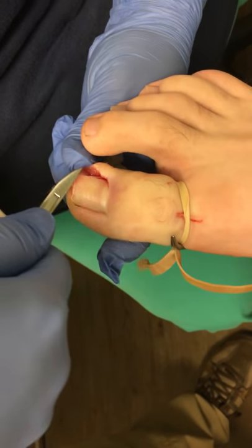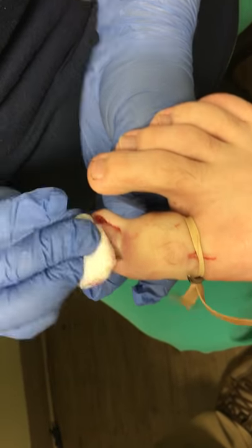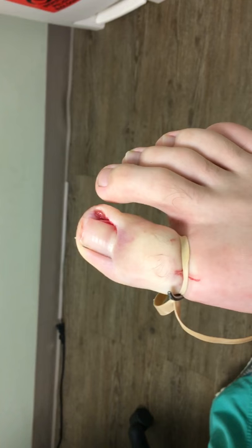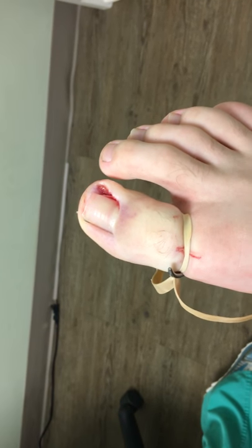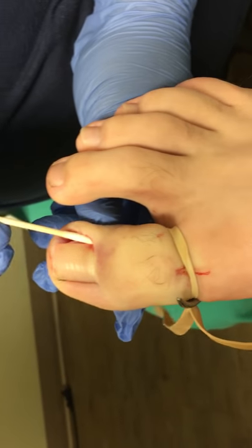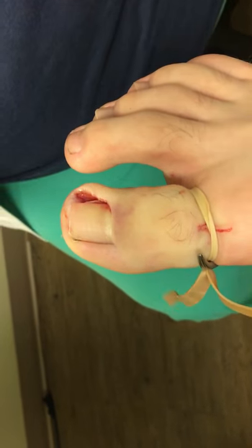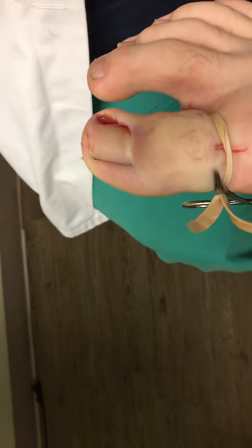Patients always come back and ask me to cut that piece of nail for them because they're afraid to do it, so I'm just doing it now. The first thing I always do is make sure that I have a minimally bloody field, because if I have too much blood pouring out of here, it'll wash out the phenol acid — and nobody wants that, because then your procedure will fail.